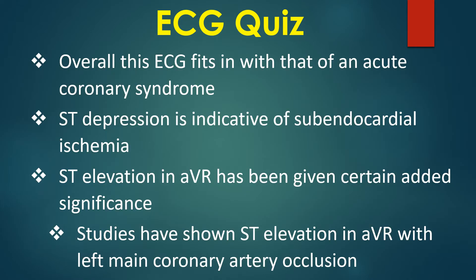Mild ST elevation is seen in AVR, marked by a black arrow, and V1, marked by a green arrow. Overall, this ECG fits with acute coronary syndrome. ST depression is indicative of subendocardial ischemia. ST elevation in AVR has been given certain added significance.